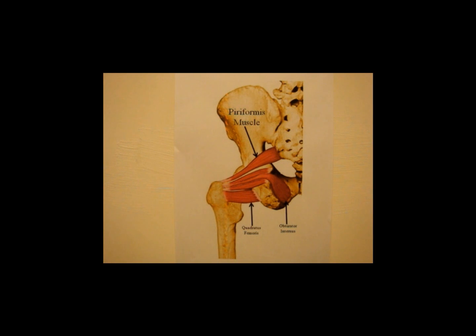This video clip will demonstrate how ultrasound guided piriformis muscle injection is performed. This is the image of the left piriformis muscle.